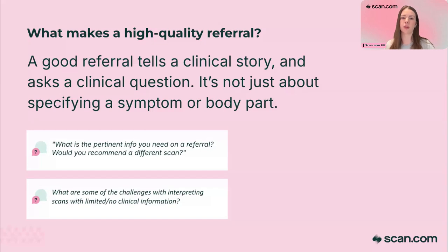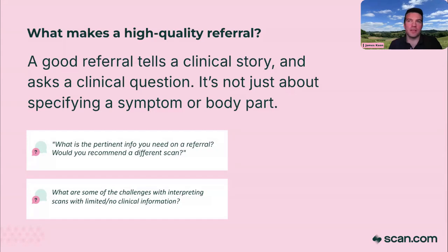I suppose there's lots of different scans that could be done for MSK, so it may depend on the scan type. I think I'll get James to answer that one. Yeah, that's one for you, James, I think. Yeah, sure. Meet first patient who's pregnant. I guess there's always the thing about the referrer being responsible for making sure the patient's safe, and it falls back into the same kind of discussion, really.